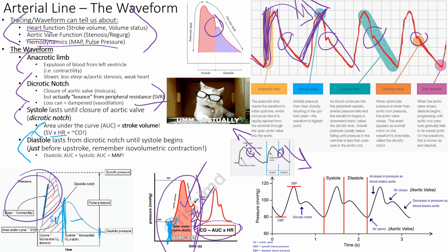When we talk about balloon pumps, it's really important that we deflate the balloon before the heart opens up and hits a balloon, right? We want to make sure that we are closing the balloon. We don't have some malfunctions there. We have definitely some chest pain for sure. So you can see here this aortic valve as it closes. Yeah, that's nice and it makes sense, but it's really a reflection of the periphery. And if you look at someone who's in really, really severe shock, you're going to see the dicrotic notch all the way down at the base, right? When you have someone that's really, really vasoconstricted, you're going to see the dicrotic notch higher up. So it gives you an idea of what their SVR is.